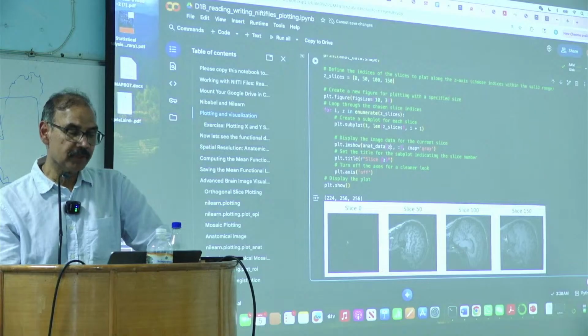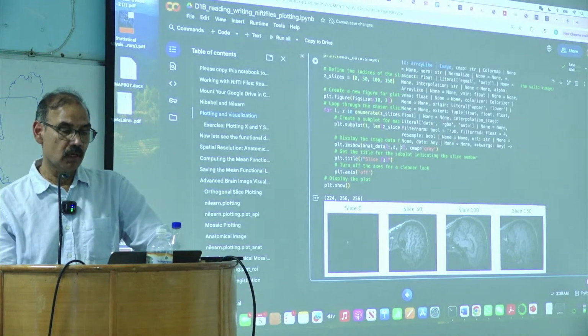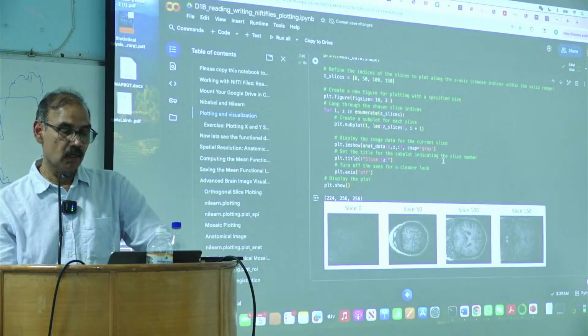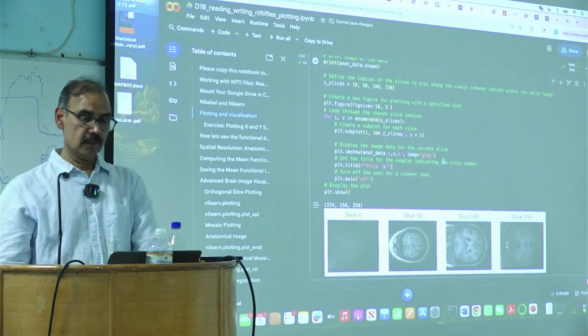Maybe someone could tell me. Colon, comma, Z. Is this going to work? Okay, so these are coronal, right?